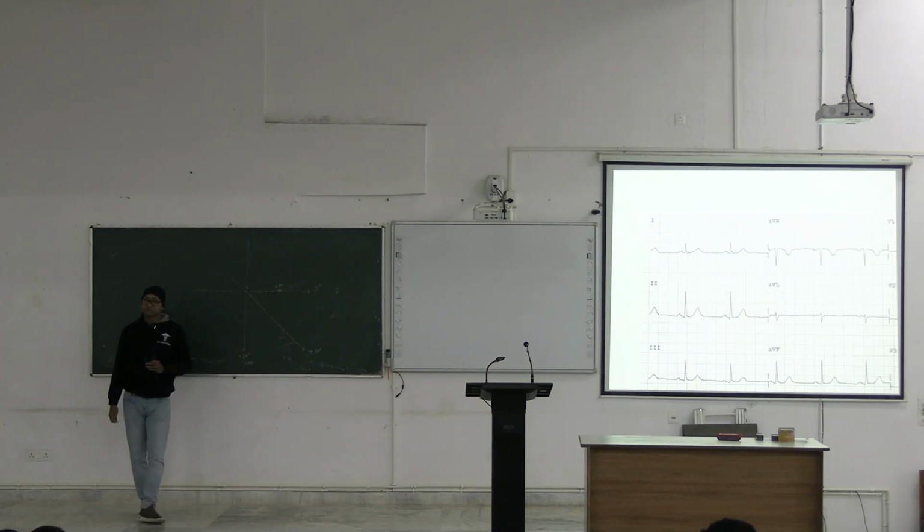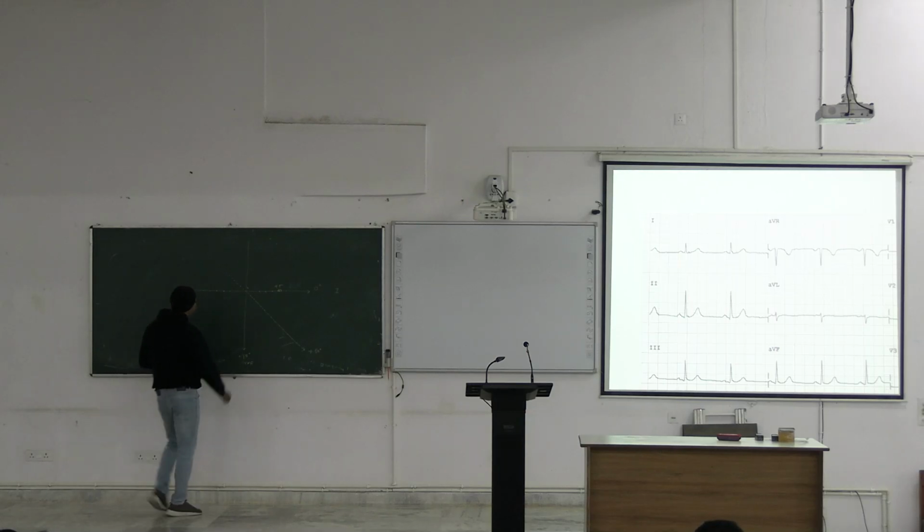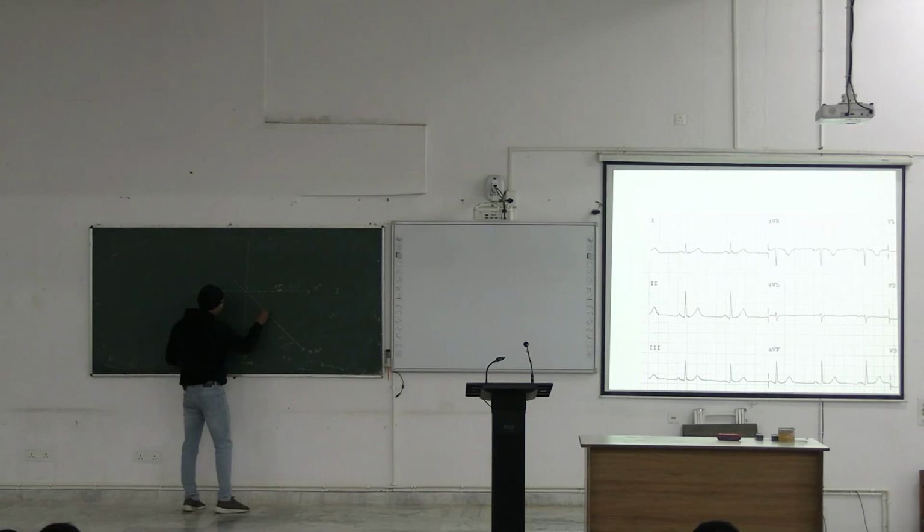Clear? Okay. Now, in case of lead 2, it is plus 11, right, plus 11, because plus 12 minus 1, it is plus 12, plus 11. Okay. So, 1, 2, 3, 4, 5, 6, 7, 8, 9, 10, 11. So, here is the point, plus 11, right.